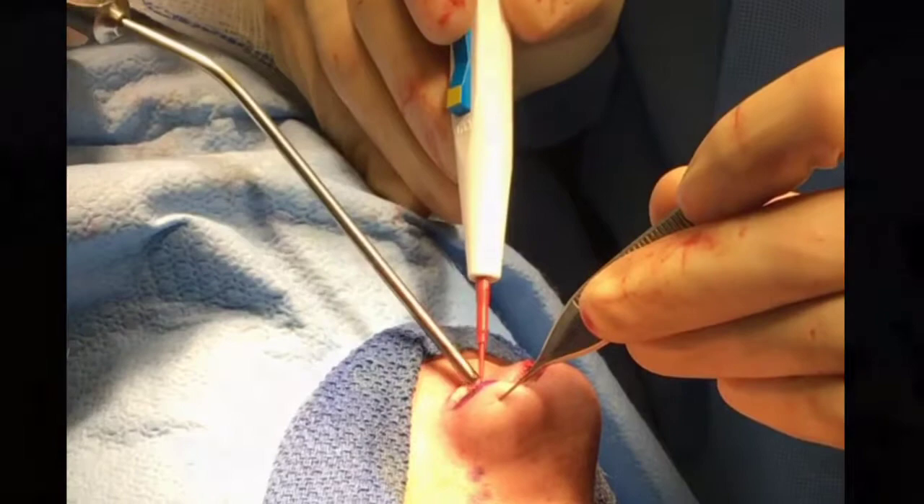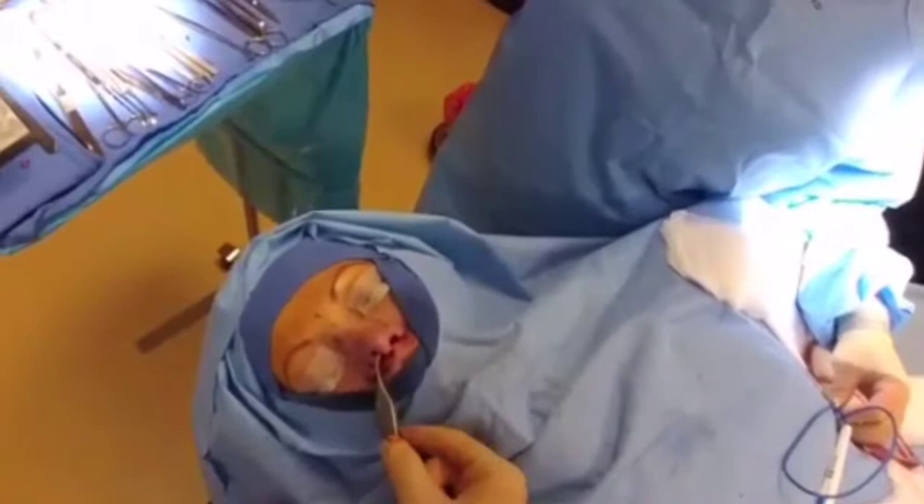We have a little bit of alar notching, so we're going to put a little graft through an incision inside the nose here and push this down a little bit.